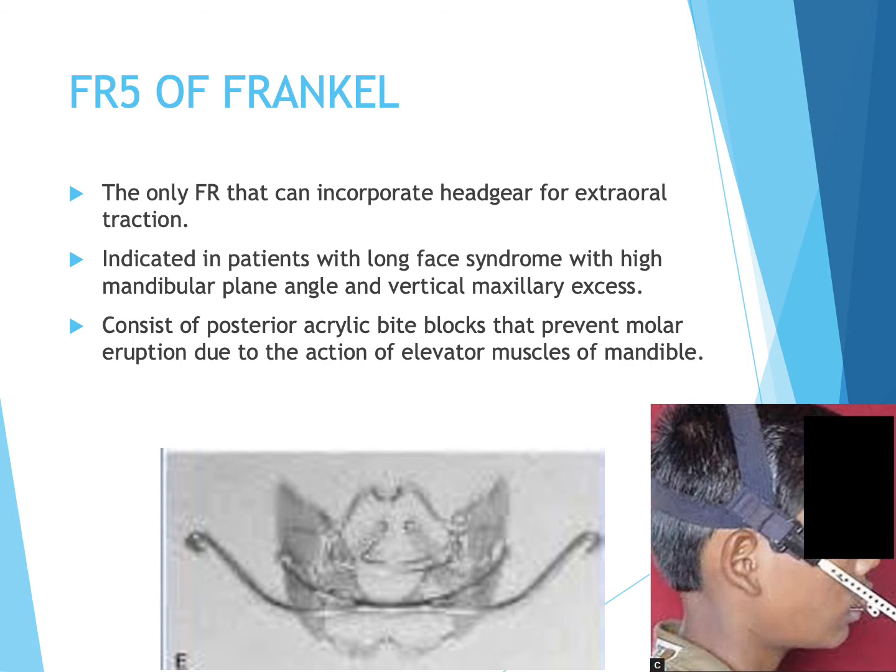Functional regulator 5 of Frankel. These are functional regulators that incorporate headgear. They are indicated in patients with long face syndrome having a high mandibular plane angle and vertical maxillary excess. The appliance consists of posterior acrylic bite blocks that prevent molar eruption due to the action of elevator muscles of the mandible. Headgear tubes are incorporated that are used for extraoral traction.